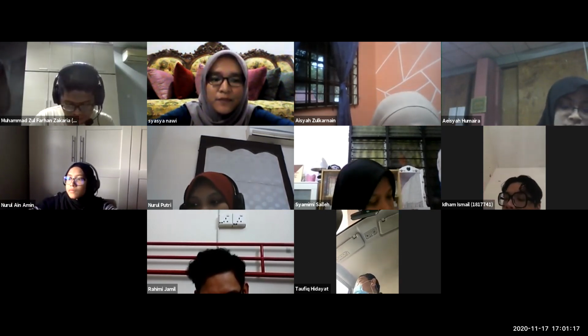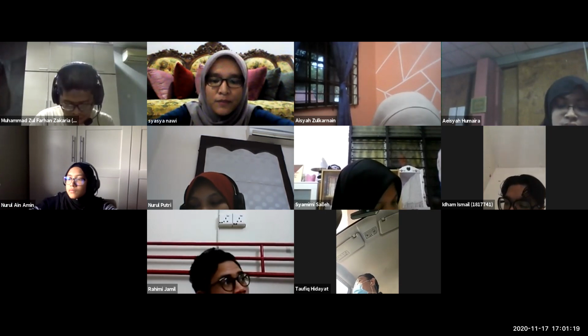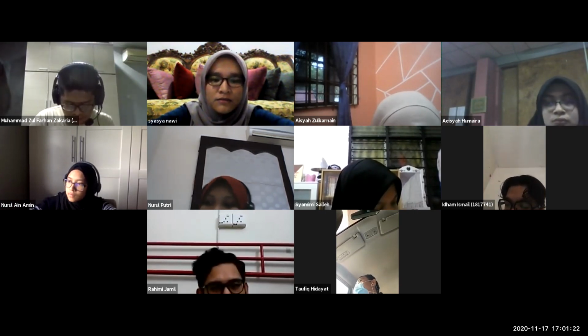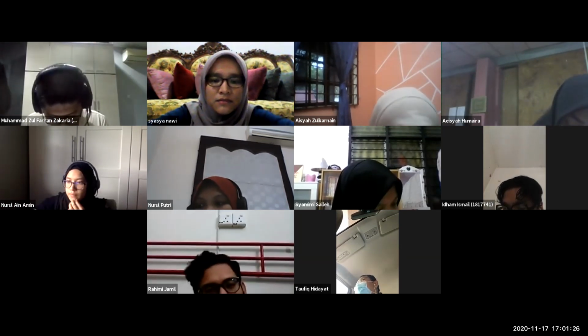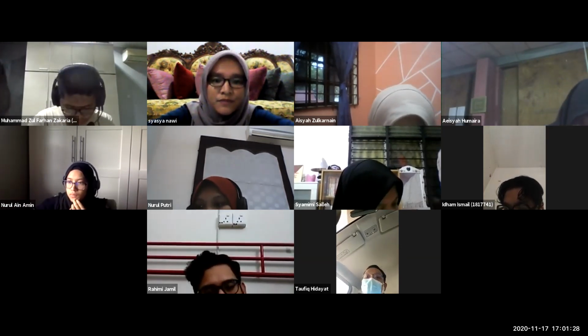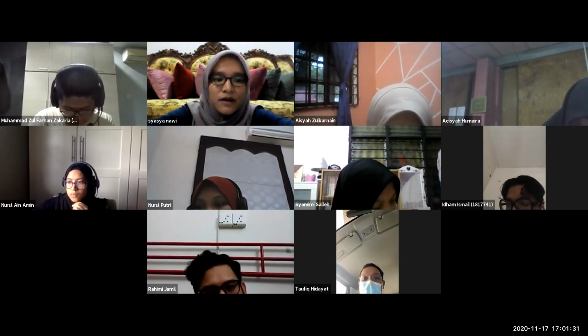That one is for a baby or small child. For a bigger child, school age or adolescent, usually the blue one. The blue one is 22. Yes.